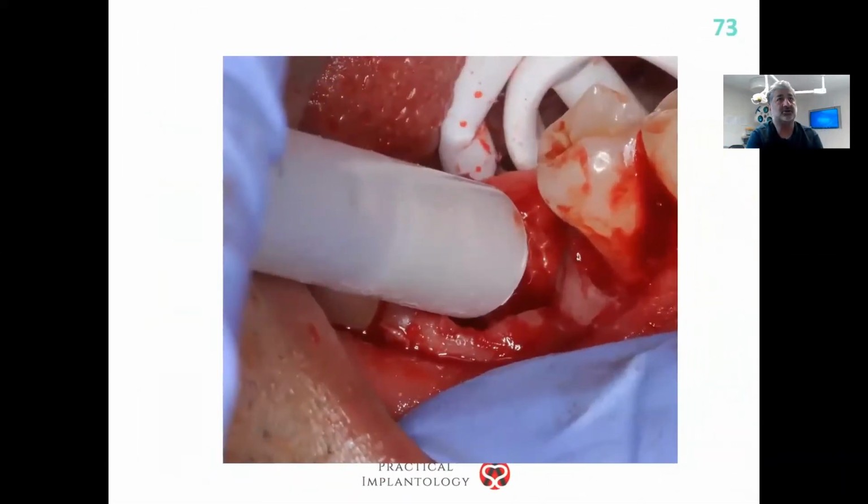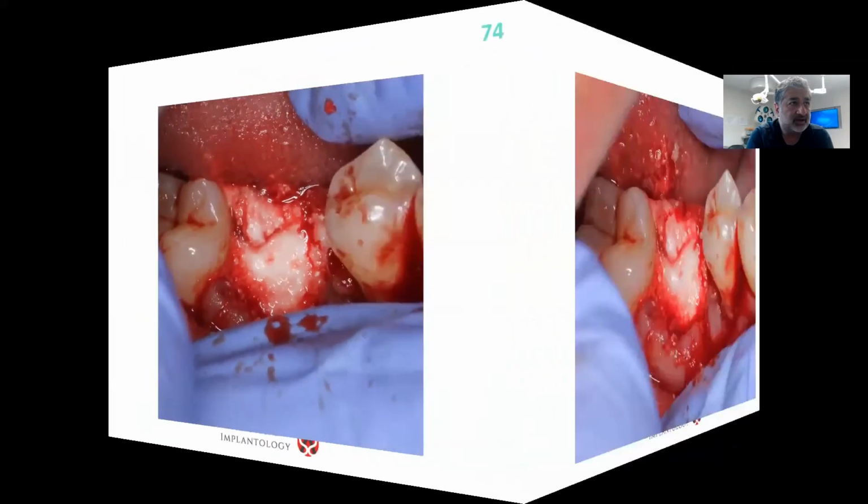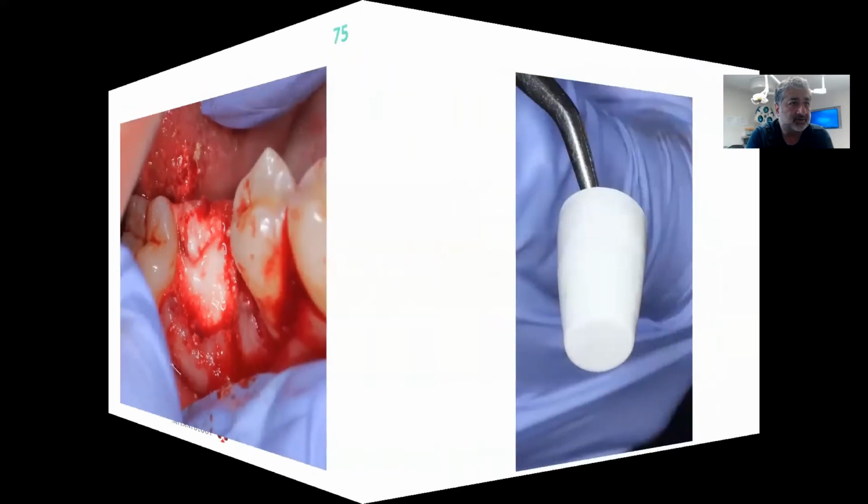I used Ethos here, which is mixed, and I placed it into the socket, which has been cleaned. I didn't have degranulation burrs then, I would have used that. Ethos is beta-tricalcium phosphate mixed with calcium sulfate. A very good mix. I placed it into the socket, and then I placed some more into the socket.